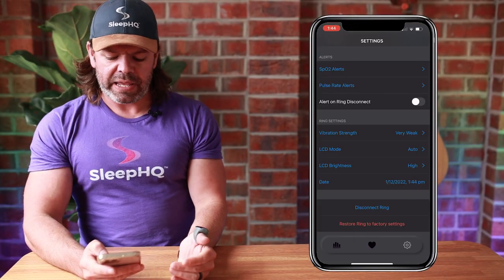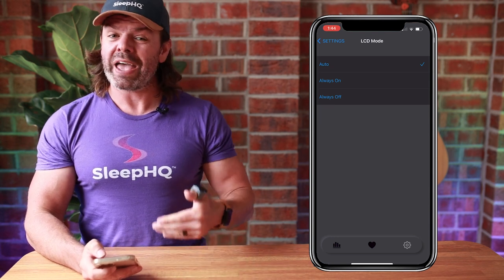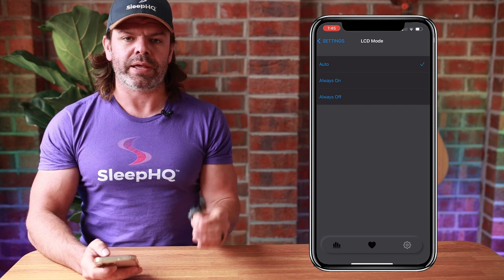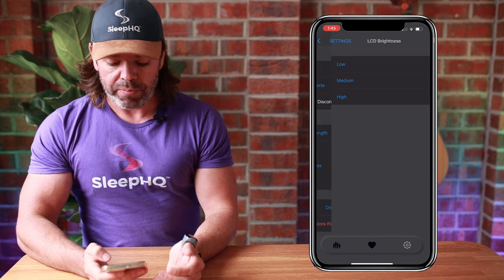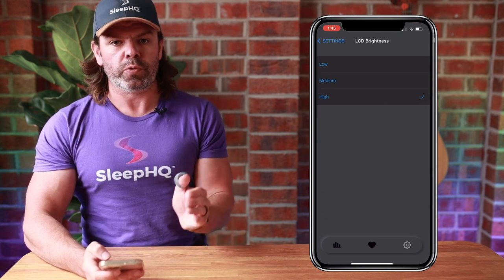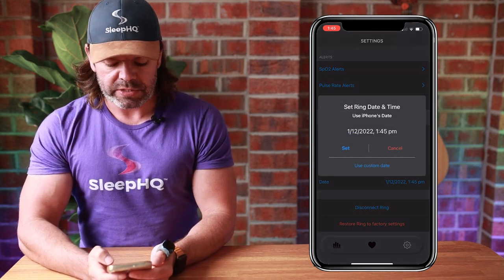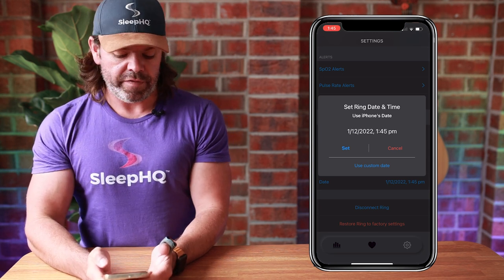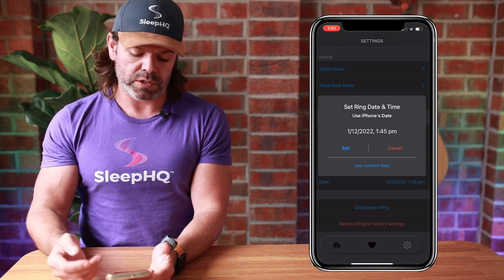We've also got LCD mode — you can set the screen to always on, always off, or automatic. If you have it always on it will drain the battery quicker, so I suggest leaving it on automatic. We've got LCD brightness: low, medium, or high — again, high will drain the battery a bit more. Then we have date and time settings where you can set the ring date and time using your iPhone's date, or set a custom date.